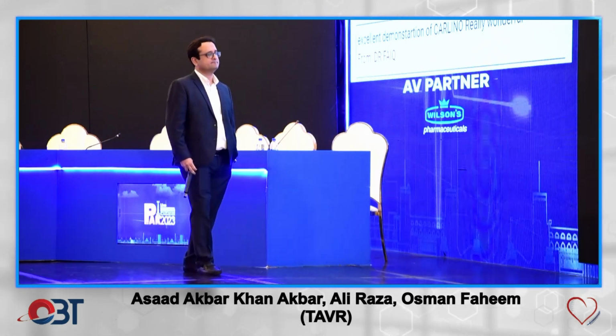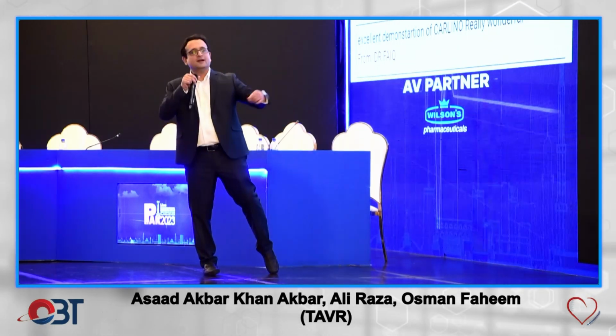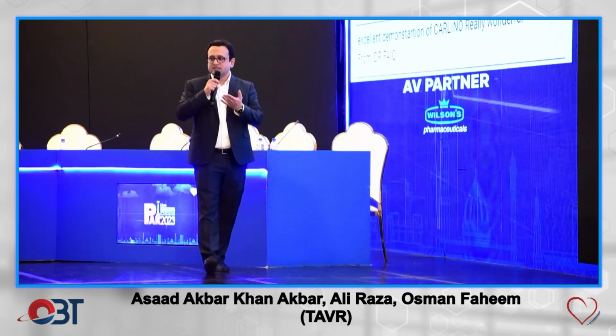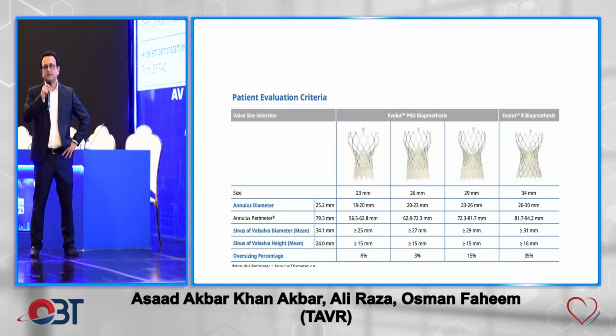Yeah. This guy has great sinuses, like minus 34. Would you go 34? No, I wouldn't. But it's still not on the borderline. I think it's still pretty good, and it's a bicuspid valve. So bicuspid probably sort of on the underside. Yeah, if it wasn't bicuspid, I would have gone at 34. I would say so.